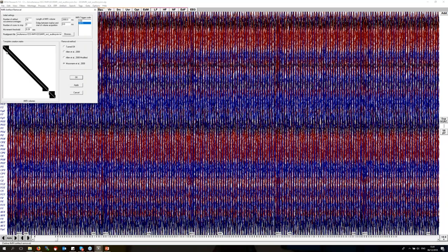You can see that usually it's the 8 preceding and 8 subsequent scans. But in the case of a motion artifact like here, instead of using this balanced one, the method will choose preceding ones rather than posterior ones, because it will give a more accurate estimate of the actual artifact. If I choose the standard Allen one, then the volumes will all be similar, but for Moosman, we have a different process of creating them.